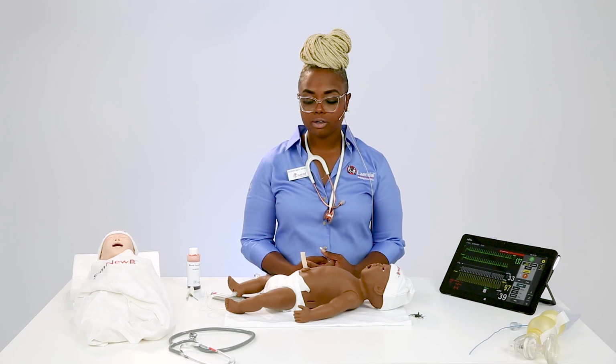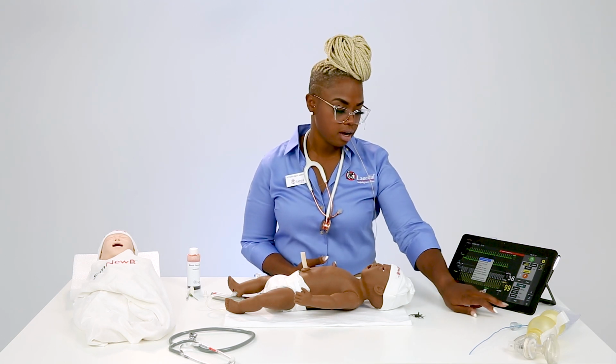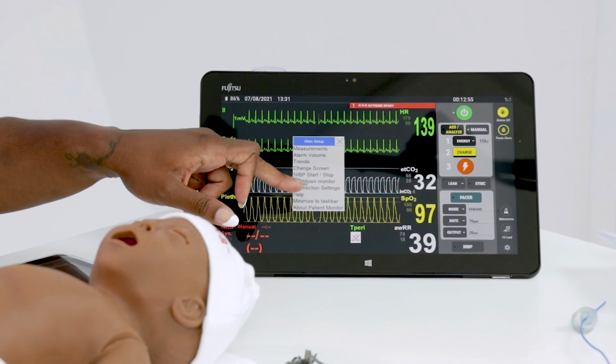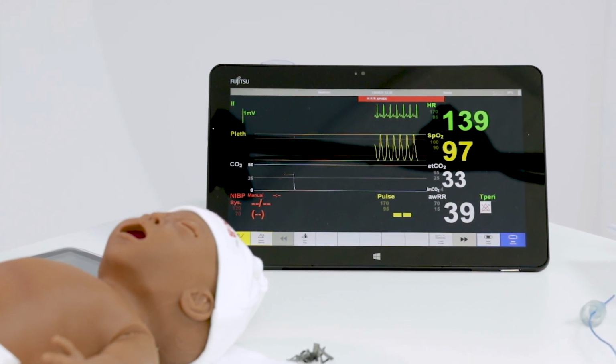All right, next question in that I see are, for a tension pneumo, can the learner insert in the mid-axillary? So needle decompression is possible. Next question I see is, can SimNewB be connected to a Philips monitor to show the vital signs? So, as far as it being Philips, that is the interface which is mimicked or simulated here on the patient monitor. So there can be no direct connection, but you can simulate that here to show that representation. So I'll go back to that monitor again, but this is modeled after the Philips monitor.